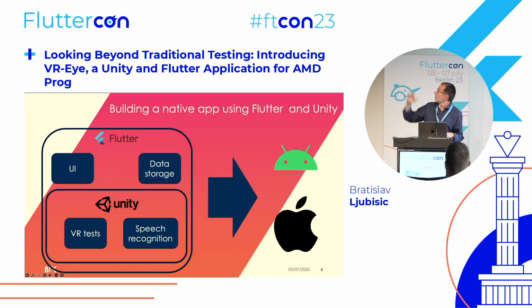This is the application that we built. This is a very high-level overview of the actual application. We have a Flutter application, which we decided on because we wanted to cover both the Android and iOS worlds, and we already knew that we wanted to use VR for some of the tests, so Unity would be included in the development of the application.